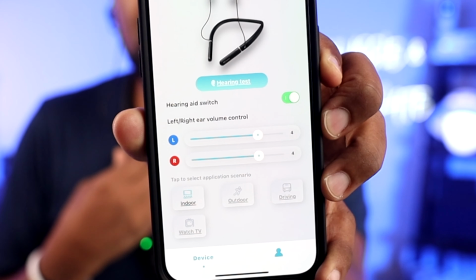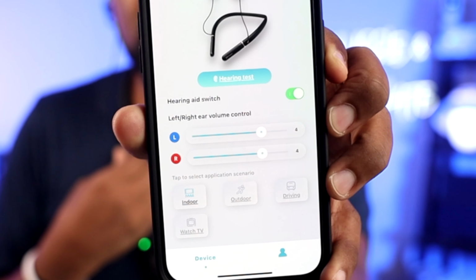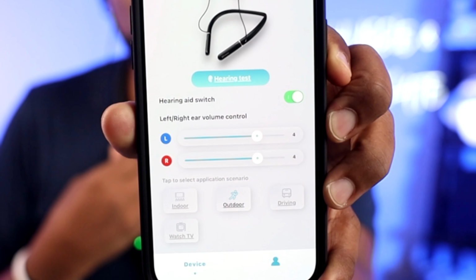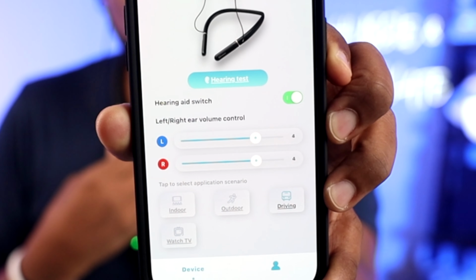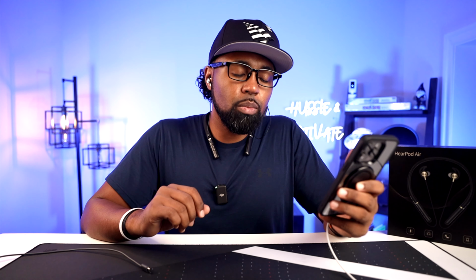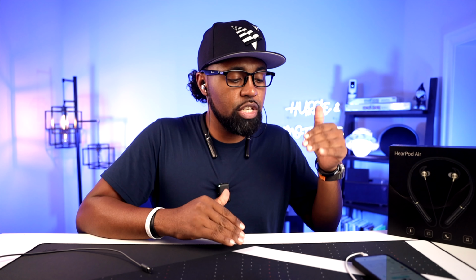The HC button toggles between your different sound modes. Right now I'm in pass-through mode, which is louder, noise reduction mode, wind noise mode, and as you can see, the icons are switching, and it says TV mode. So that is pretty much the app in a nutshell, people. The only reason why you do need the app is just to set it up in the first place, and then everything else can be adjusted right here. You don't need to have this app running the entire time for these to work.